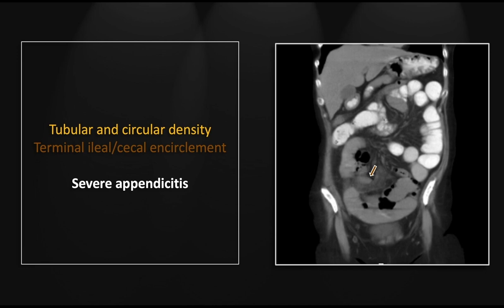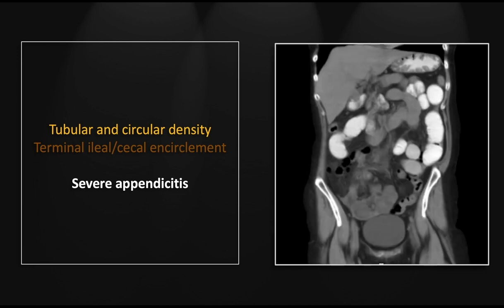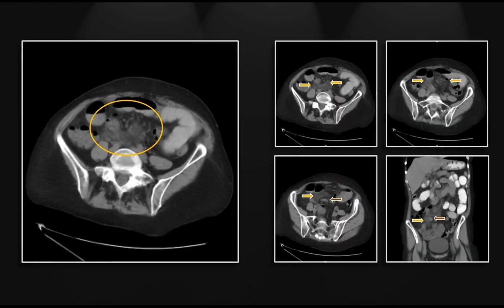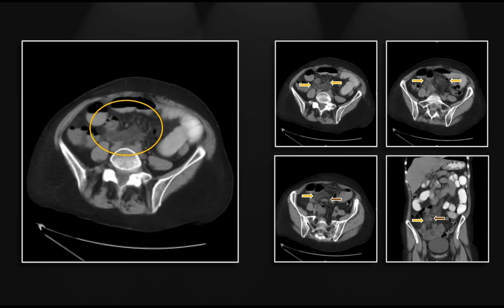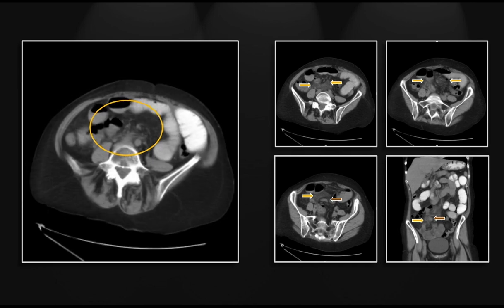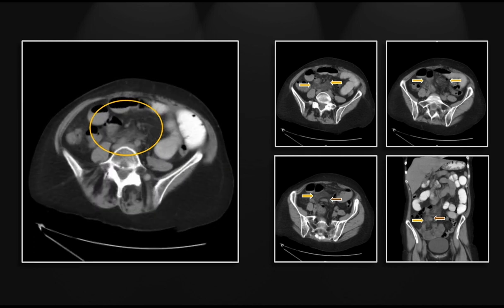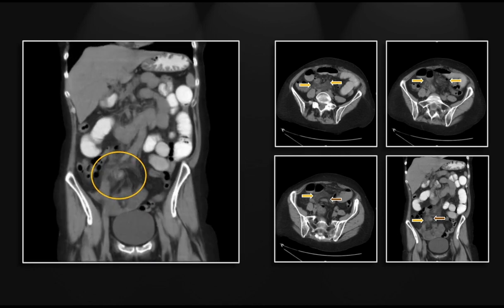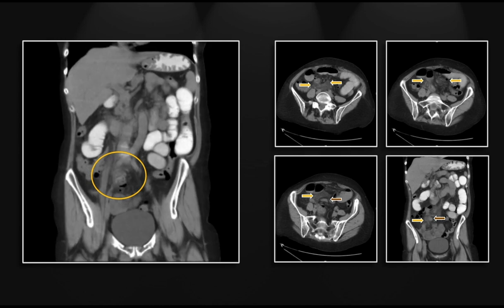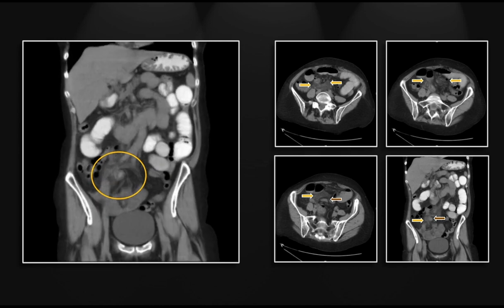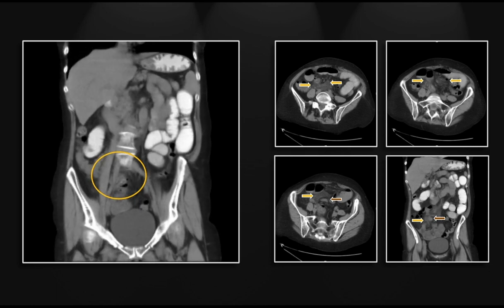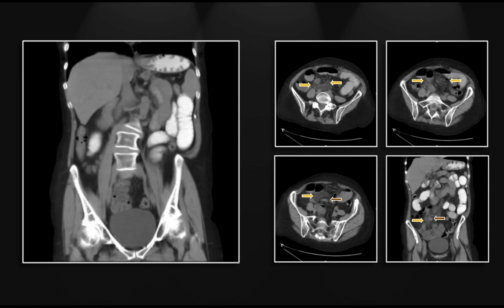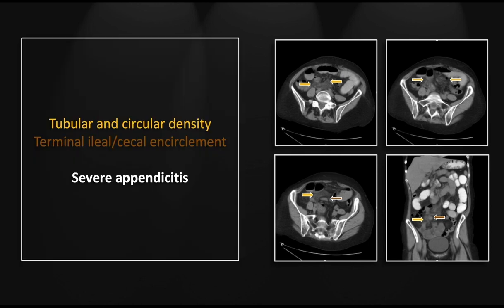Even further back, you can again see that barely visible appendix and the encircled terminal ileum. Follow it in a complete circle — that ghost of a dilated, stranded appendix makes a perfect circle that encircles the terminal ileum, visible on the coronal as well. That is one of the more severe cases of appendicitis I've ever seen, with associated obstruction of the terminal ileum.